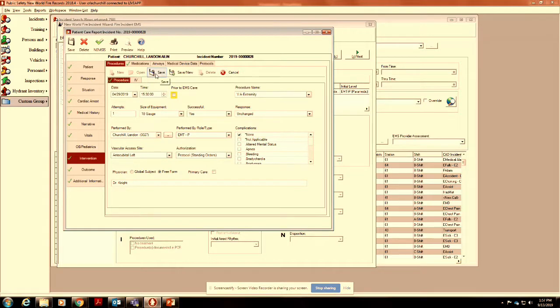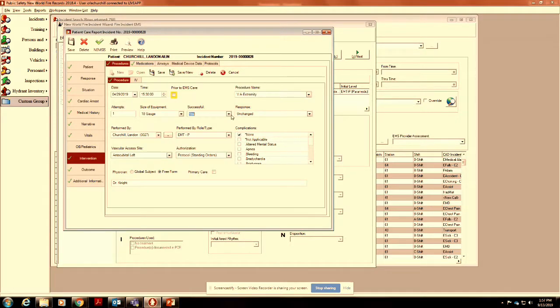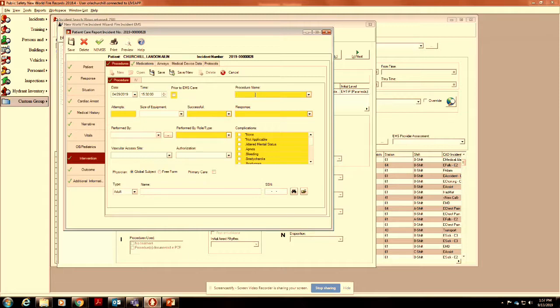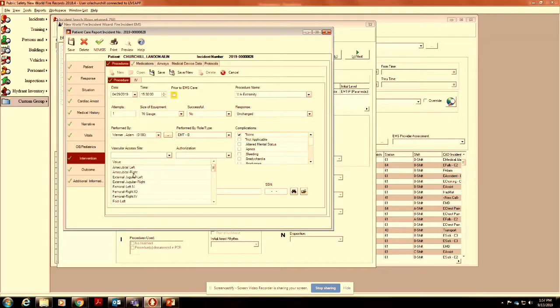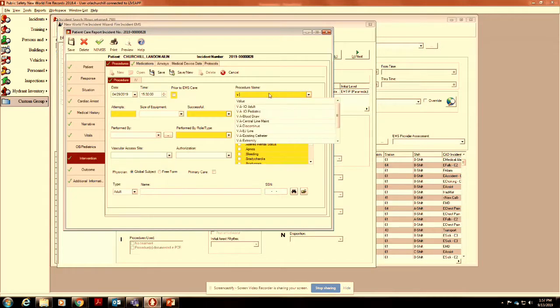So to give you a little example of what this looks like with multiple IVs, let's say this first one was one attempt, but I was not successful. Whoops. All right, well, now I need to do another one. Extremity, again, always one attempt. My partner's a little more ambitious than I am. Warner tries it, he misses. He shot at the antecubital right. So now we've blown both the ACs. Man, terrible. Now your third one.